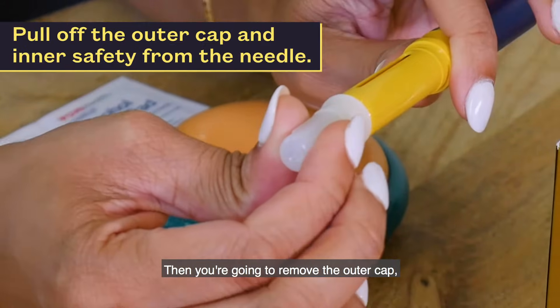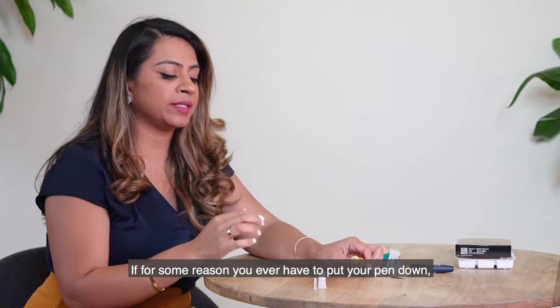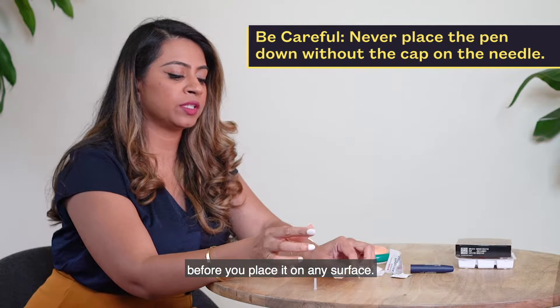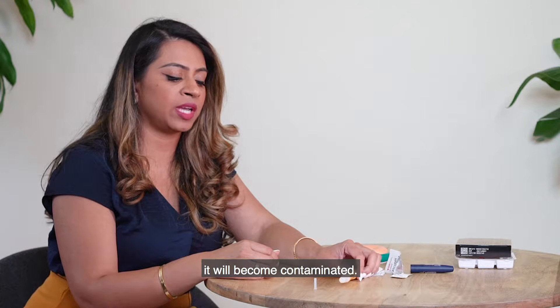Then remove the outer cap and the inner cap. If for some reason you ever have to put your pen down, make sure that you put the cap back on before you place it on any surface, because if that needle touches anything it will become contaminated.